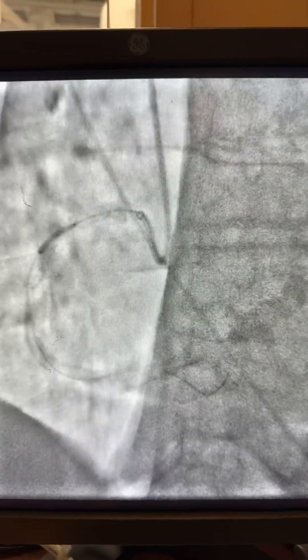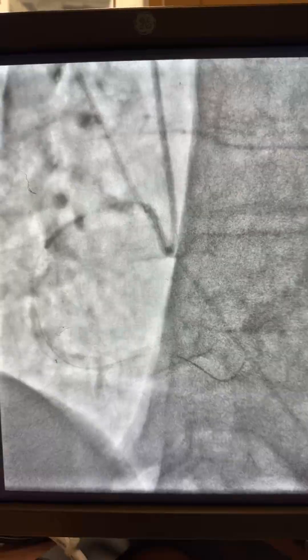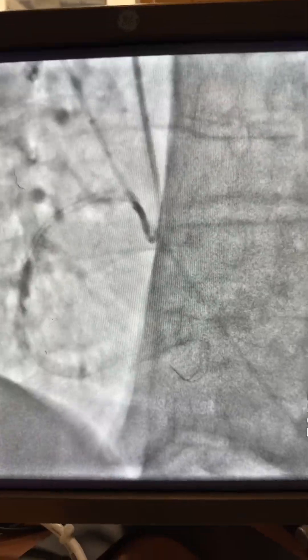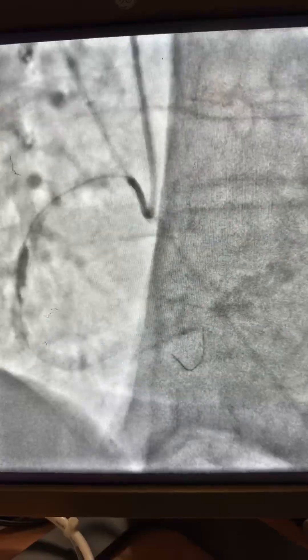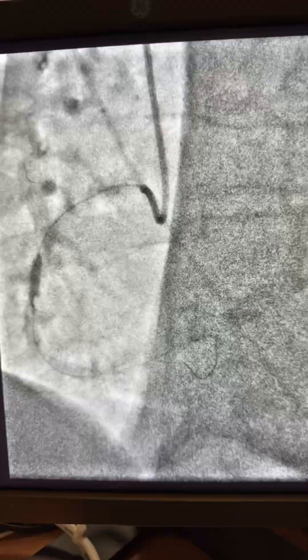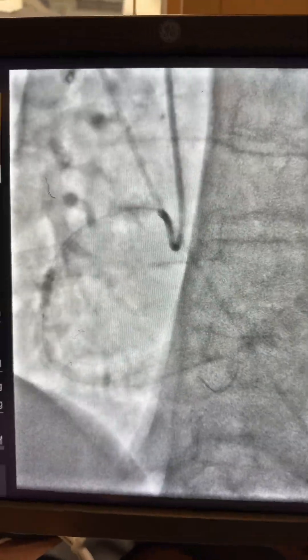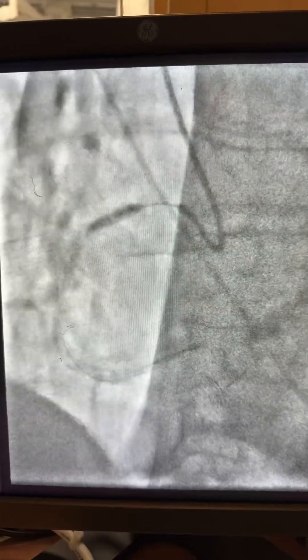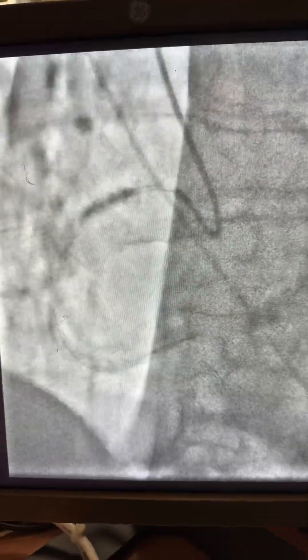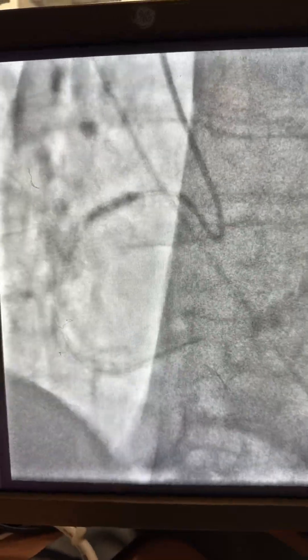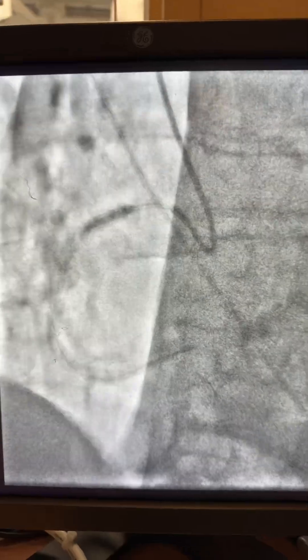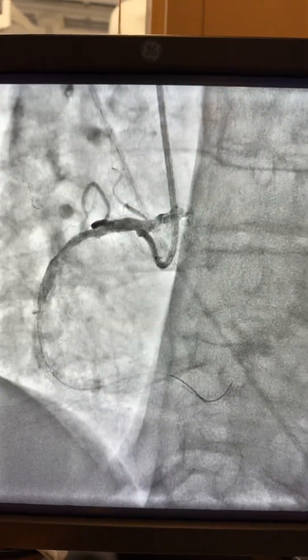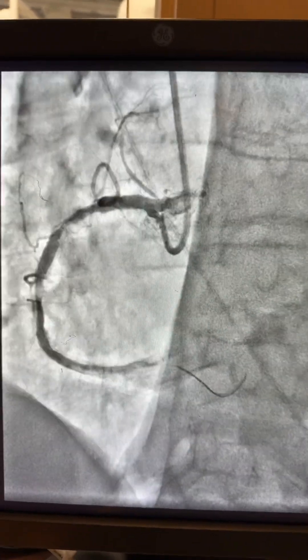Once the run-through wire was passed, a 2-0 balloon was advanced for the proximal and mid segment to give some room for the bulky shock wave balloon. Then we used the 3.5 millimeter shock wave balloon in the mid segment, followed by another shock wave balloon in the proximal segment of the RCA.